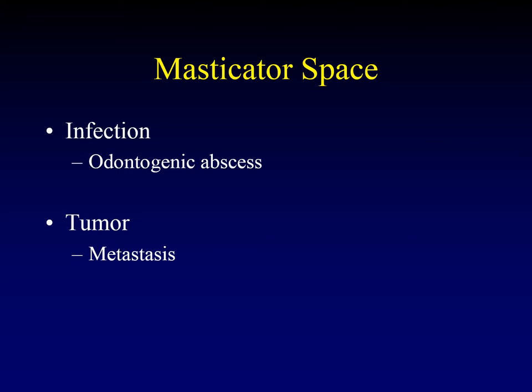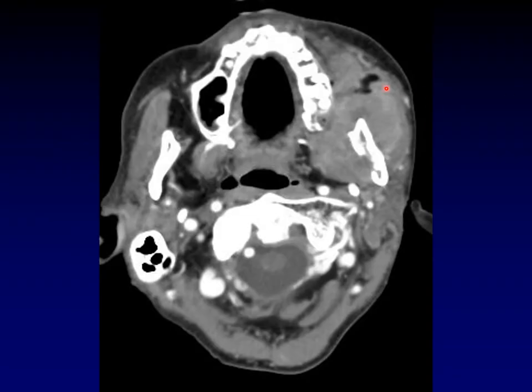There are many different types of tumors; metastases are quite common. Here's an example of a mass arising within the masticator space. You can see how it is pushing on the parapharyngeal fat posteromedially. This has a very mass-like appearance, but it turned out to be a chronic infection.